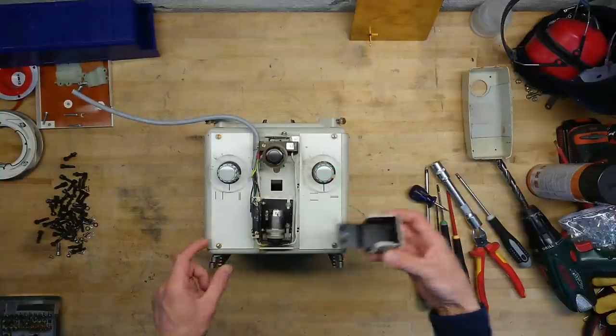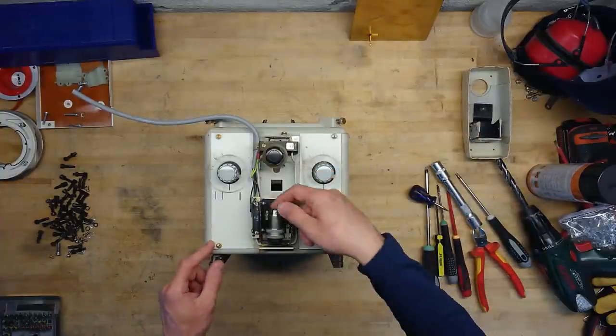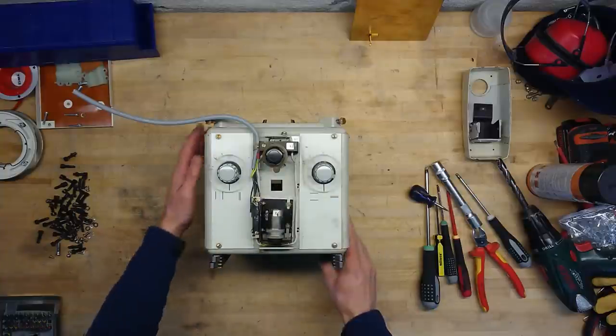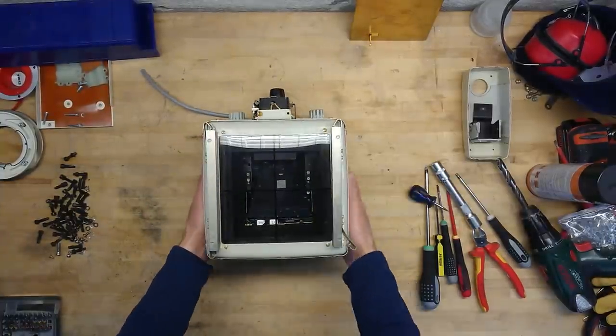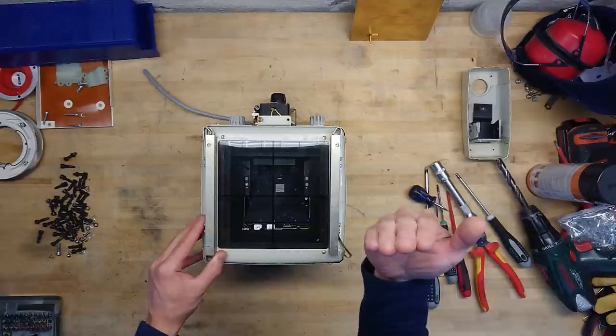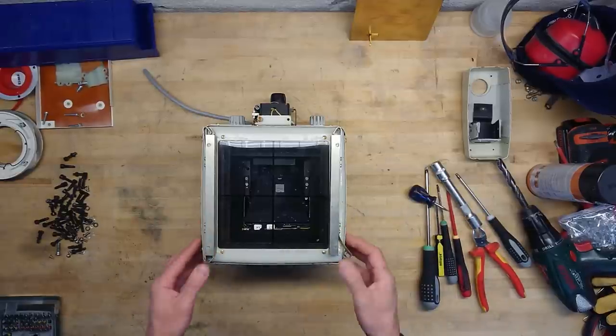There's a little bayonet socket here for a small lamp, which will only light through this small hole. And once we get inside, we can see that there is a mirror here, which the X-ray goes straight through. So let's get the shielding off and let's see what's inside.